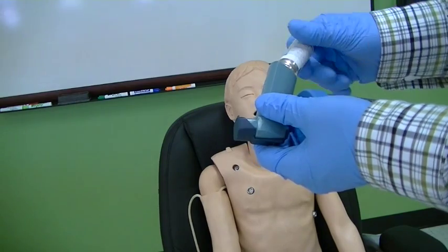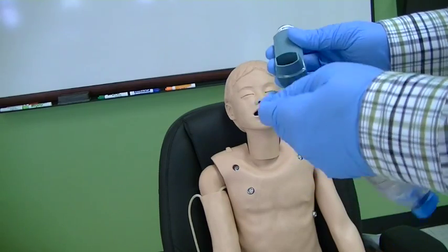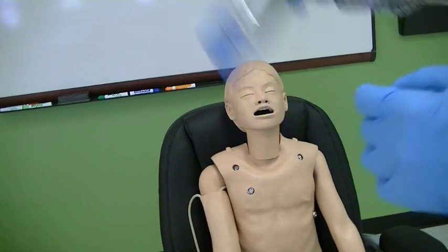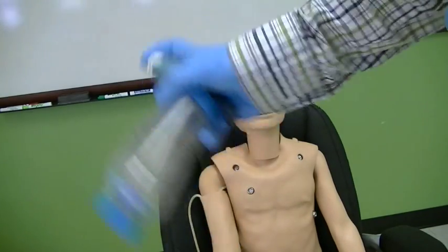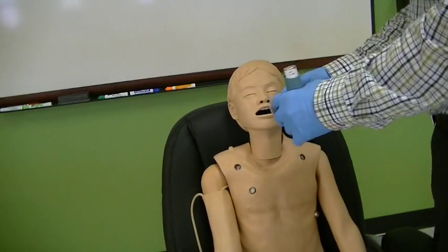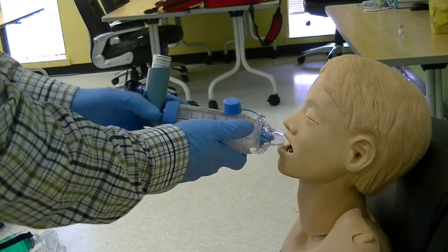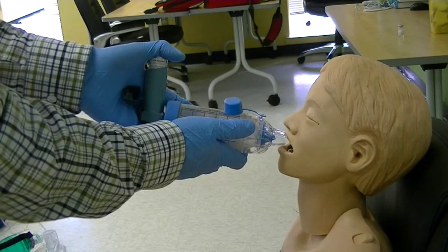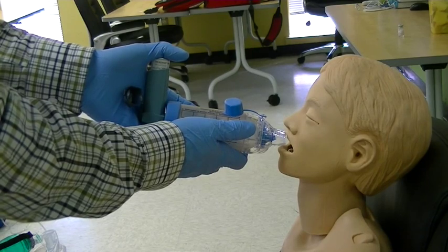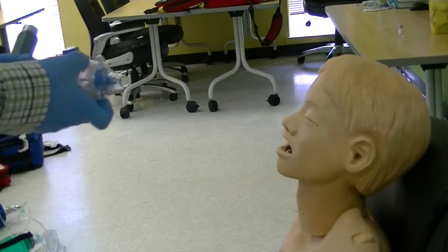Confirm the order for the medication and explain the procedure to the patient. Check the medication for correct medication and expiration date. Snap off the cap and insert into the spacer. Shake the inhaler well. Place it in front of the patient's mouth and instruct the patient to exhale, then place the mouthpiece in the patient's mouth. Instruct the patient to close lips around the mouthpiece with tongue under the mouthpiece. Press the bottle and mouthpiece together quickly as the patient inhales. Instruct the patient to hold their breath for 5 to 10 seconds. Repeat in 5 to 10 minutes or as instructed.